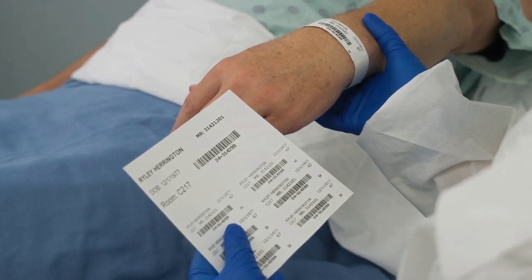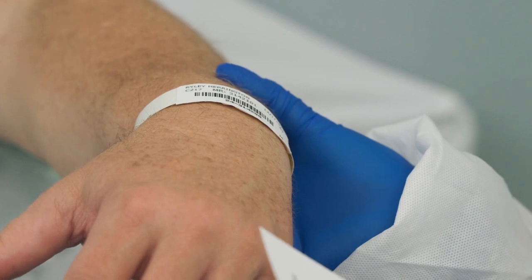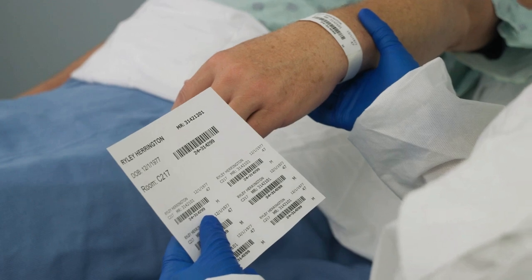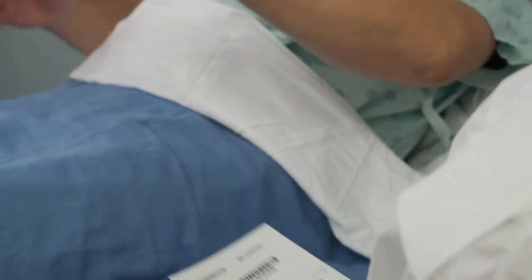Before starting the collection procedure, confirm the patient's identity. Check that the requested laboratory test and patient information matches the patient's identity. This could be done using a printed label, form, or mobile device.